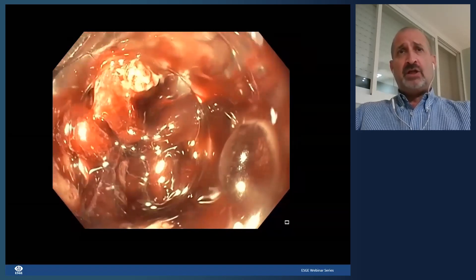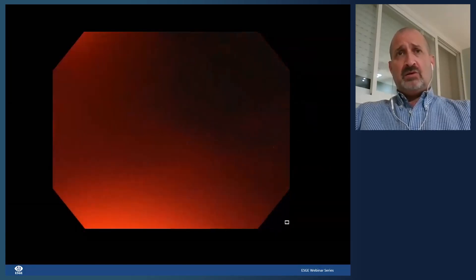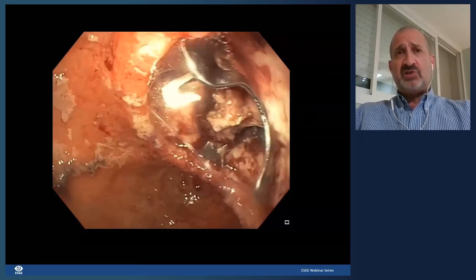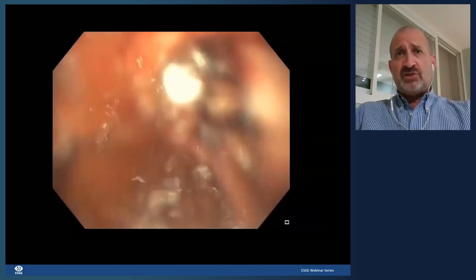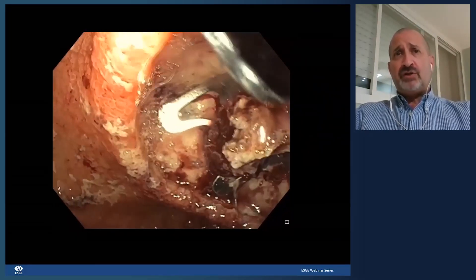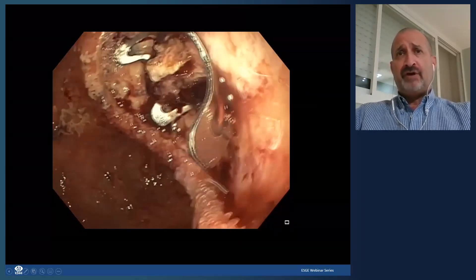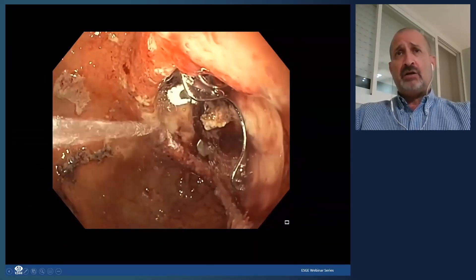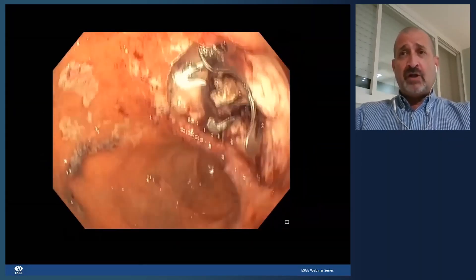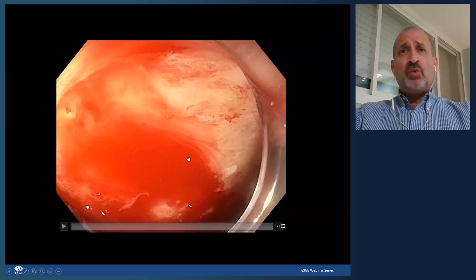The clip has been released and you can see now that the bleeding has completely stopped. For these large fibrotic ulcers where other treatments are difficult, cap-mounted clips can be very effective. You can see the clip in place and there is no more bleeding — a very nice case.